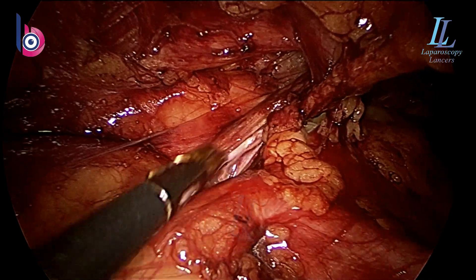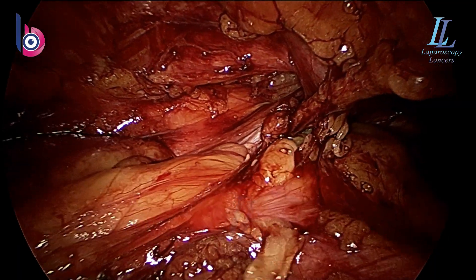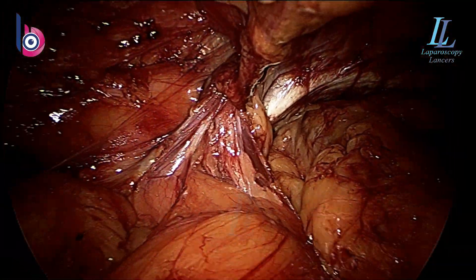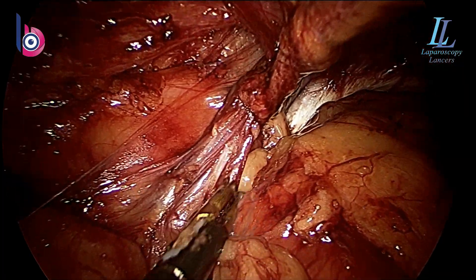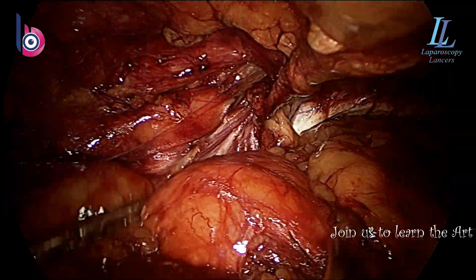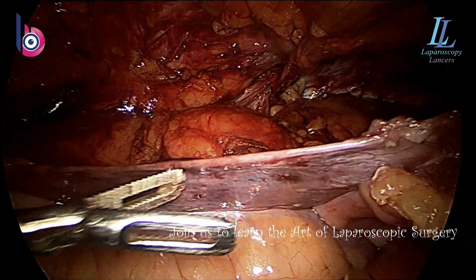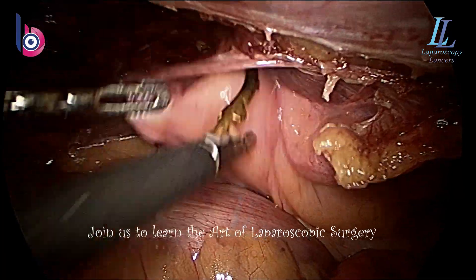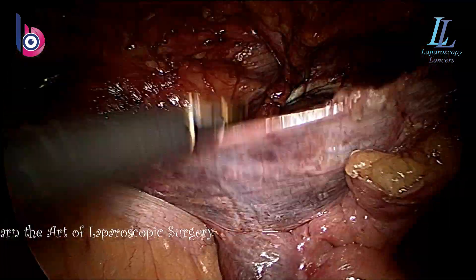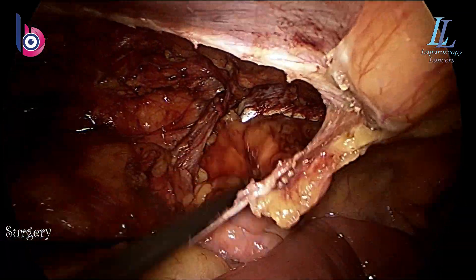Step by step we are going away from the hernia site. There you can see the hernia. The sac I am holding on the left side, and I will be pulling it out intraperitoneally — so this is the extraperitoneal site. Dissection continues step by step. We have to preserve the vas as well. That's the vas you can see turning towards the left, towards the medial aspect. Now dissecting a bit of loose areolar tissue, and there you can see the sac has come out beautifully — that's the most important part. Later I will show you that I will tag this sac with the peritoneal sutures.